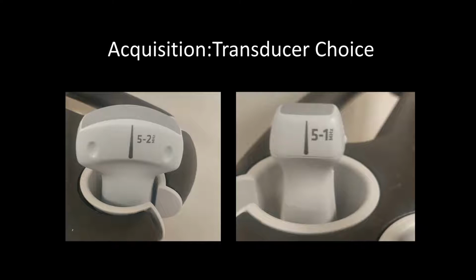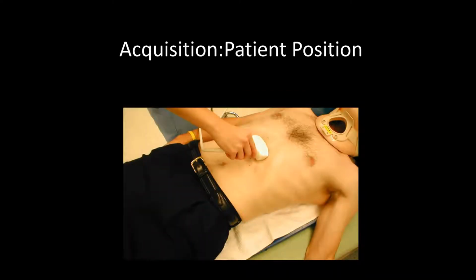First, we're going to pick our transducer. Both the curvilinear and phased array transducers make good choices for this exam, as they give you good depth and penetration as well as decent resolution. To perform this exam, ideally we want our patient lying supine. However, if they can't tolerate this secondary to pain, respiratory issues, or any other situation, the patient can be examined in the semi-recumbent or lateral decubitus position as well.